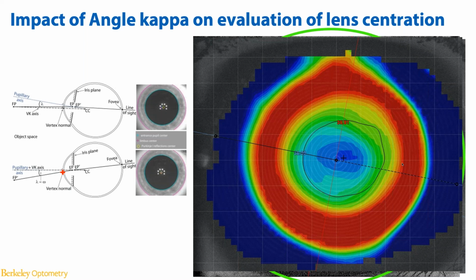But I do want to say that striving to achieve a smaller treatment zone at a significant cost of losing visual performance, especially at dawn and dusk or with nighttime glare, is probably not fully supported based on the evidence we have so far.